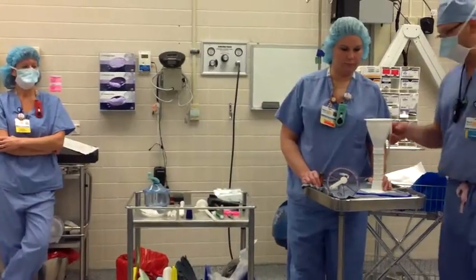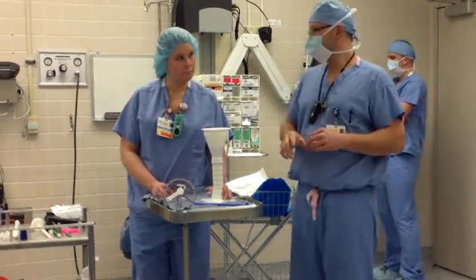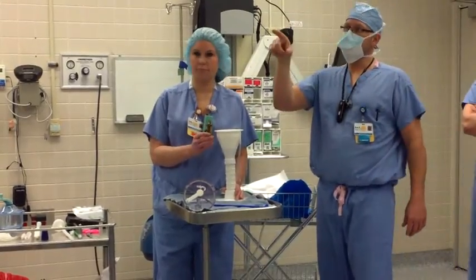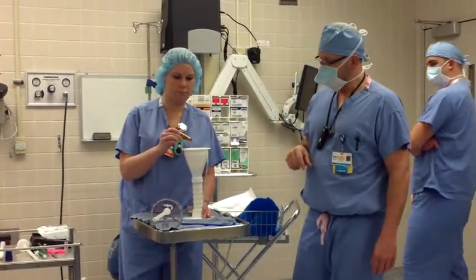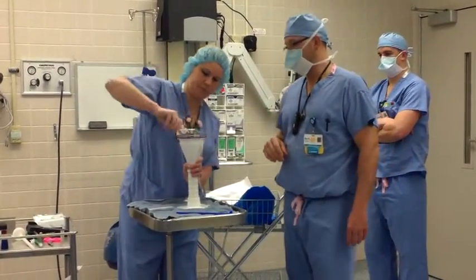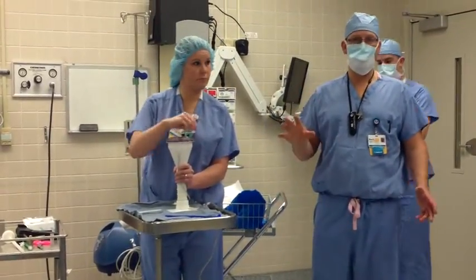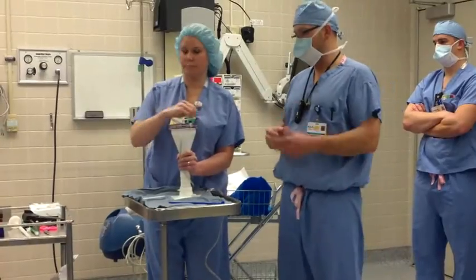Kelly's got the stuff here ready. She's going to pour that in there. I always tell everybody in the room we're mixing, so everybody knows you're on the clock. When we're mixing, the nurse has to go over and hit the clock — the stopwatch is the best thing to use. You just need to do the two minutes. Once it's poured in, always remember those glass vials go in your sharps container. She's going to pressurize up to 20. If this thing is not hooked up, which does happen, start mixing anyway — you can mix it without being pressurized. It's still going to work; it just helps make the cement more dense and gets the air bubbles out.